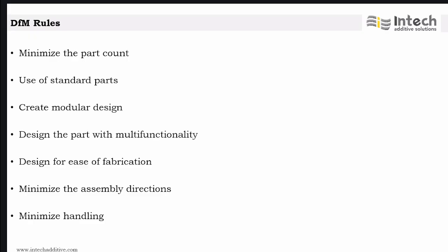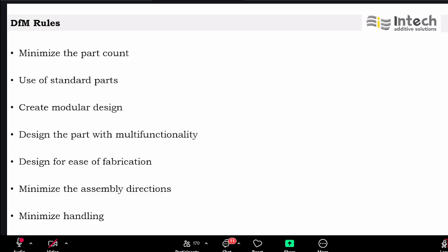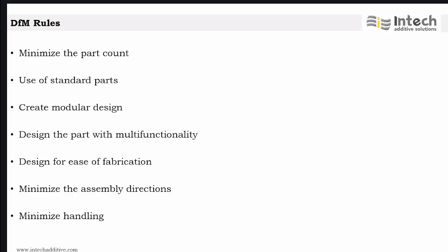And last is about minimizing handling. Every part that is picked up, moved, or oriented increases the cost, and the risk involved will be high. We need to design parts that stay in position, do not tip over, and can be stacked very safely. So it reduces the touch points, and also the complexity and labor. That is the purpose of minimizing handling, and that has to be taken care of during the design phase.